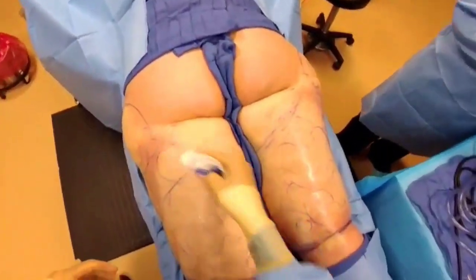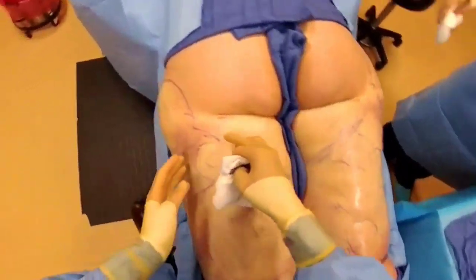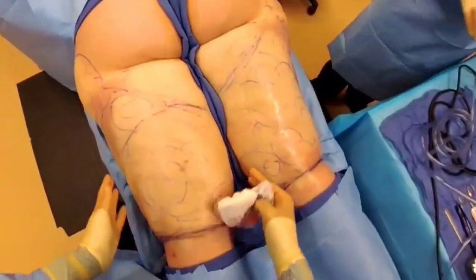Starting with the liposuction of the thighs behind the knee, so we're going to go all of this here — make that smaller.